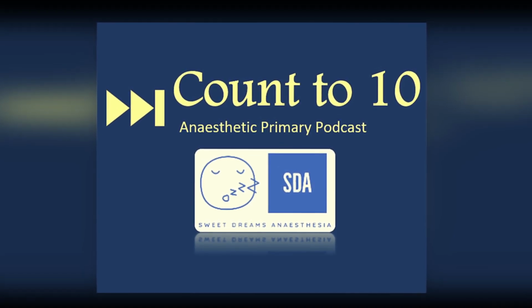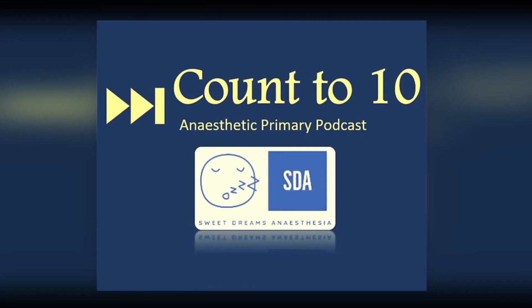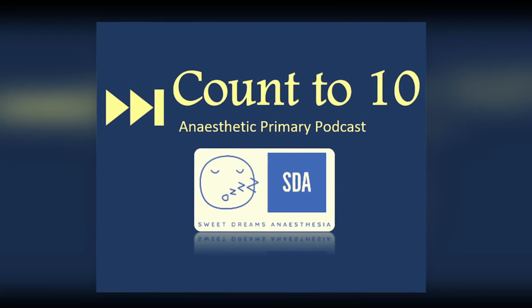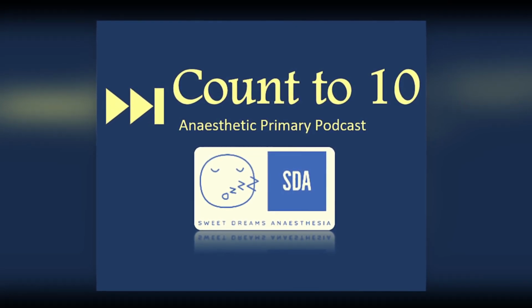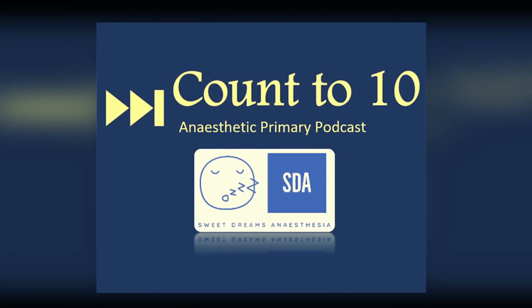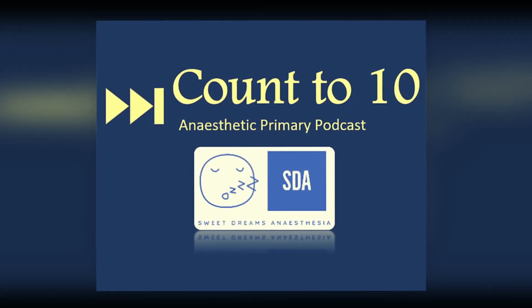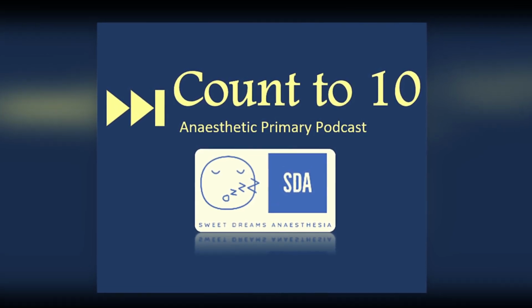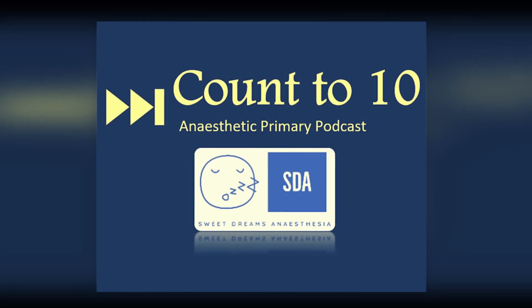When we go down and look at the probe level, we can think of lots of issues that happen between the probe-patient interface. Commonly, these will be things like poor positioning, movement by the patient, or increase in ambient light. Ambient light becomes an issue because then it starts to affect how much light is absorbed by oxyhemoglobin and deoxyhemoglobin. And the way the probe mitigates that itself is by having that sequence of red light on, infrared light on only, and then both lights off.